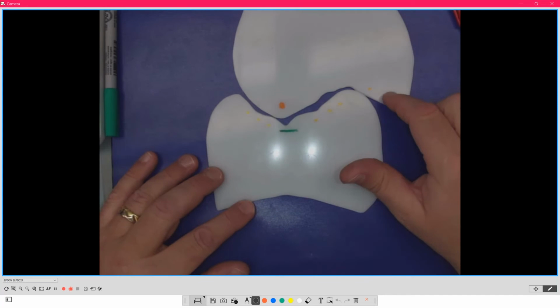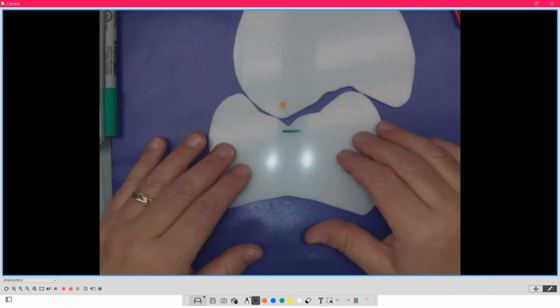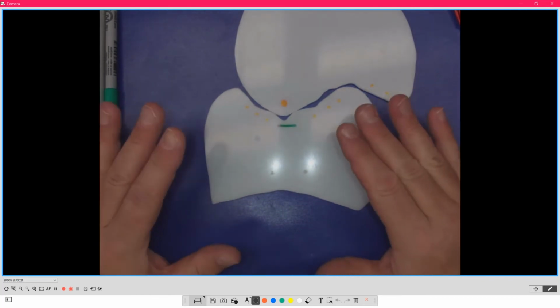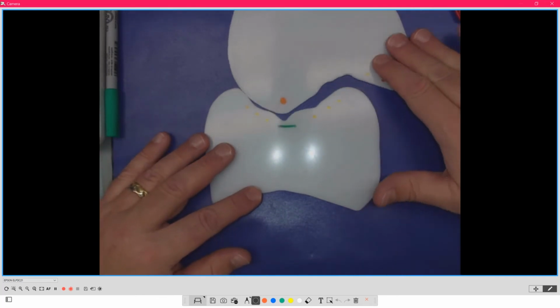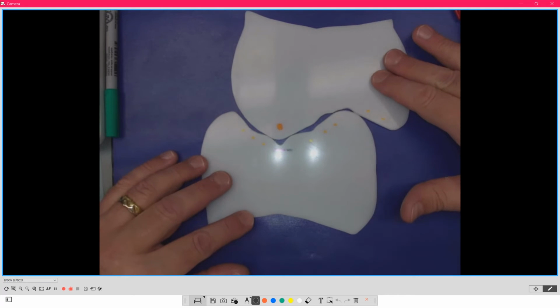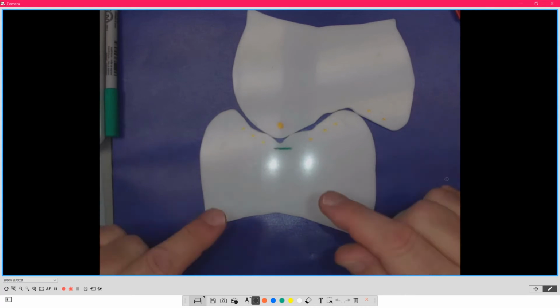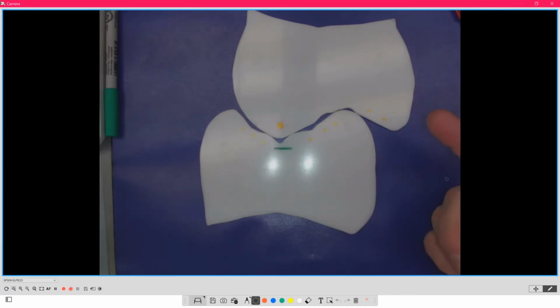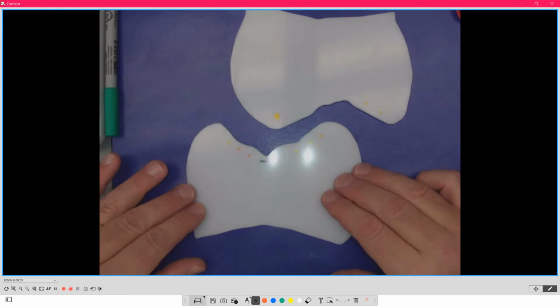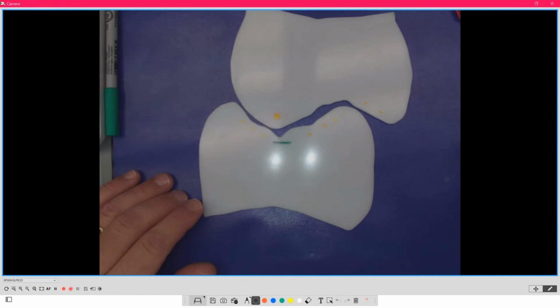The buccal cusp here is the shear cusp. They're there to help hold the food and keep it in this zone for this system to keep mashing and pulverizing the food. Okay, so you can set up what's lingualized occlusion, yet you don't have to have that buccal cusp tipped up all the way so that it would look unsightly. You can supply this to your doctor and still have a nice buccal overlap, and the patient can't tell. This is a lingualized occlusion without it looking like lingualized occlusion. That's the beauty of this. And that's the beauty of now identifying a chew cycle, and if it's more horizontal, I'm going to make that adjustment in one's mouth. So I'm going to switch.